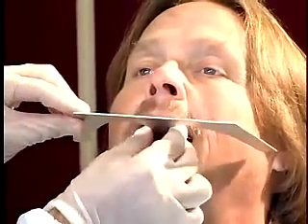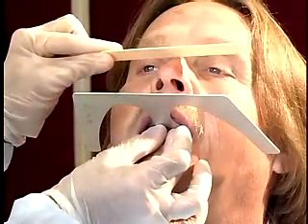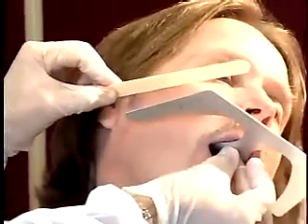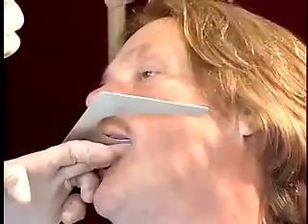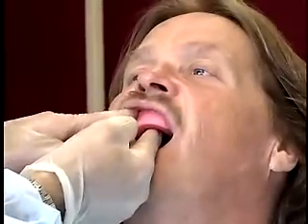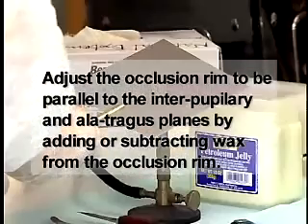Determine the relationship of the planes of the wax rim to the interpupillary line and the ala tragus planes using the Fox occlusal plane indicator and a tongue blade or 2 tongue blades. Remove the maxillary record base and occlusion rim from the patient's mouth. Adjust the occlusion rim to be parallel to the interpupillary and ala tragus planes by adding or subtracting wax from the occlusion rim.